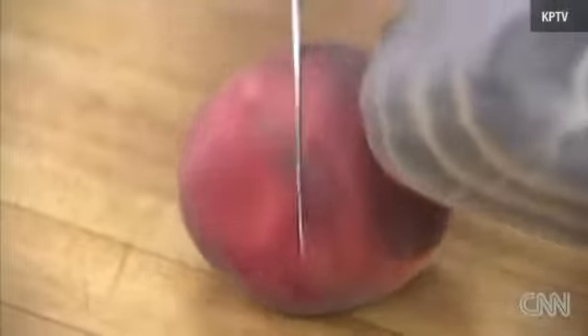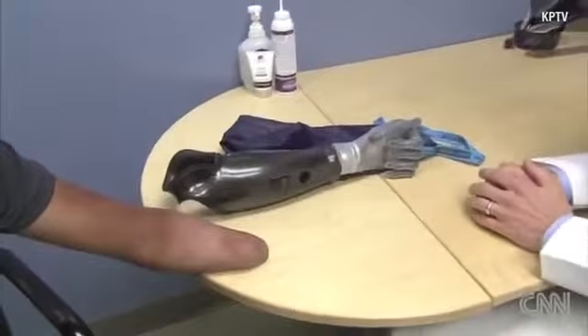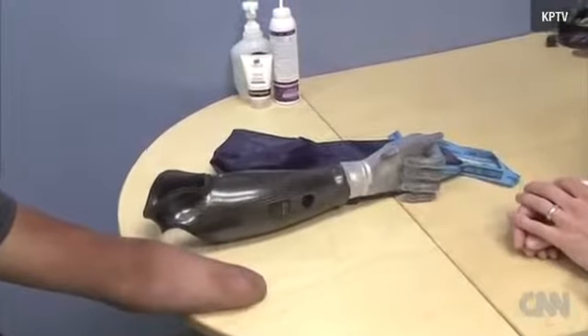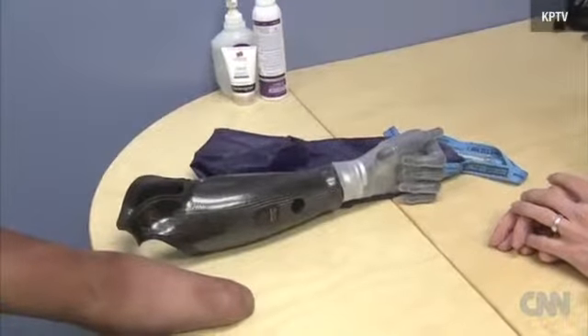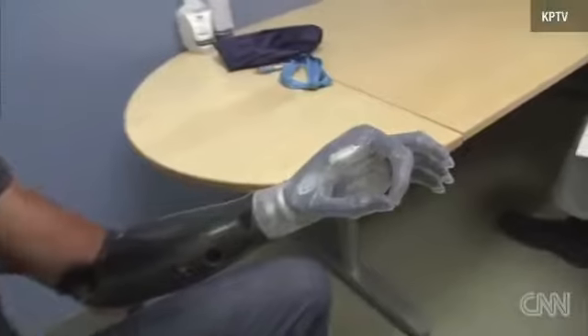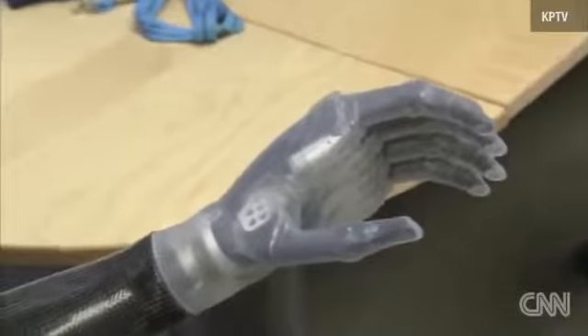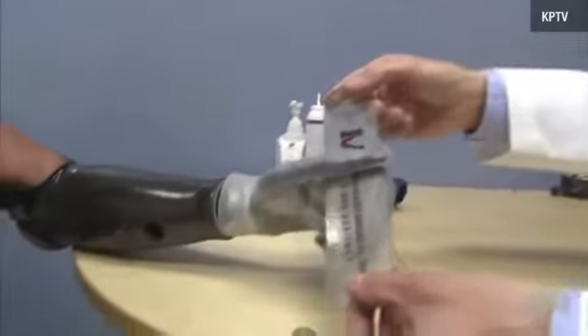Still, cooking requires two-handed dexterity. Garcia came to Portland to Advanced Arm Dynamics to be fitted with his new prosthesis. This bionic hand is the latest and greatest in the rapidly evolving field of prosthetic technology. The sleeve of the bionic hand fits tightly over his skin so that his skin connects with electrodes in the prosthesis. That allows Garcia to use the muscles in his forearm to control his new hand's movements.